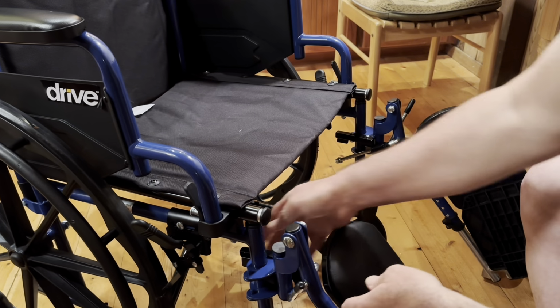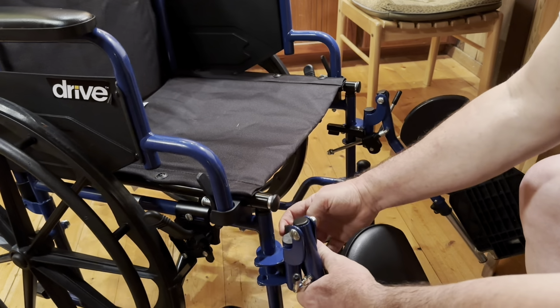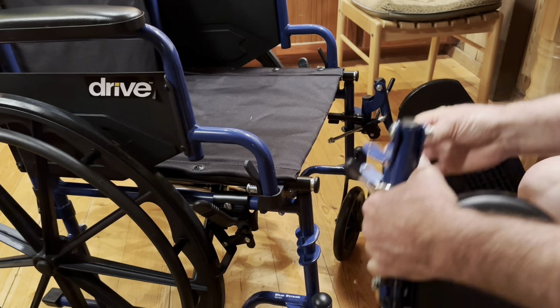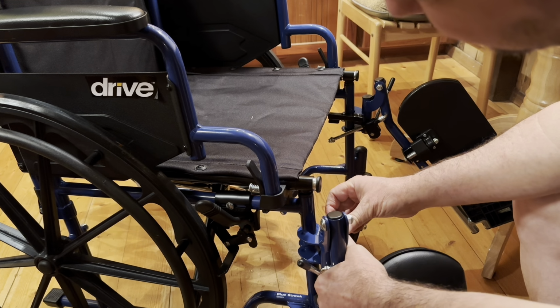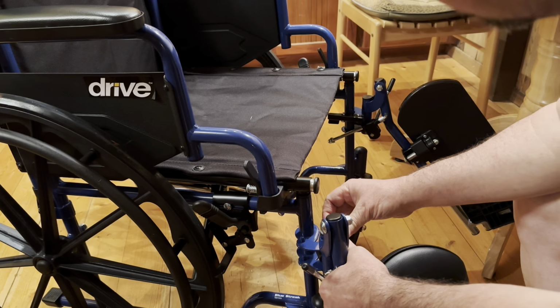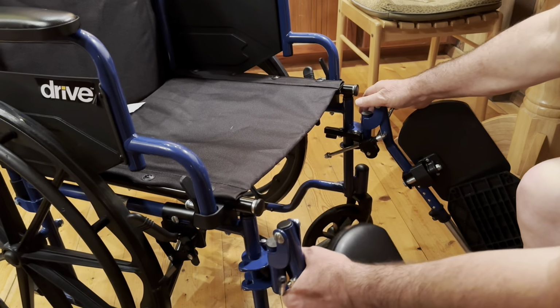These can actually come off quite easily. You just lift that bar and lift the whole leg off. To put it back on, you line up the pins with the holes. That clip or that bar is spring loaded. You just turn it in.